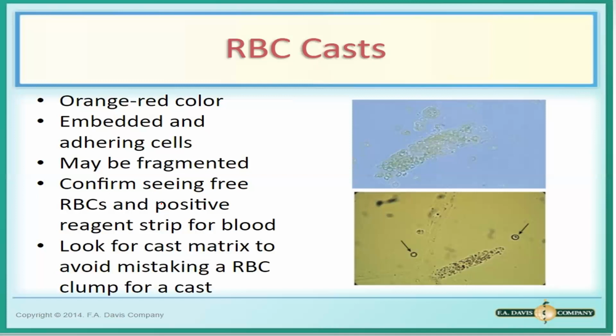Okay? So katulad nung we talked about sa chemical examination. Kapag because of renal damage, you can see cast. Because of urogenital tract problems, you cannot see cast. Okay? When hemoglobin is degraded to methemoglobin, you can see dirty brown cast.